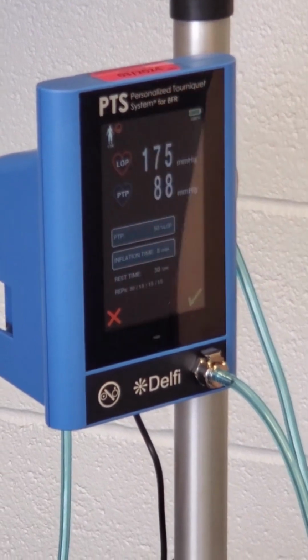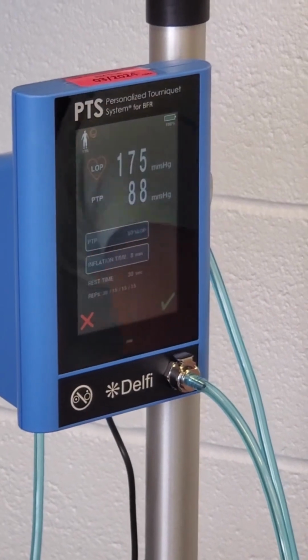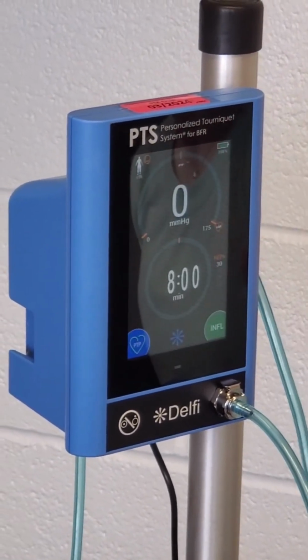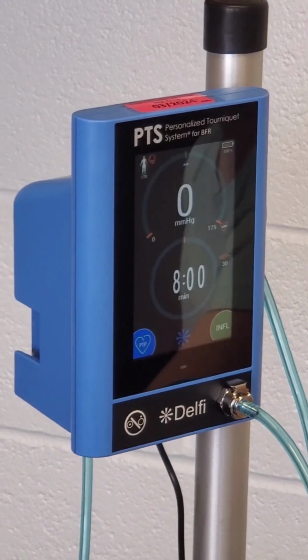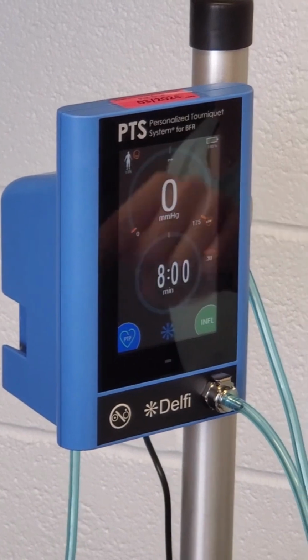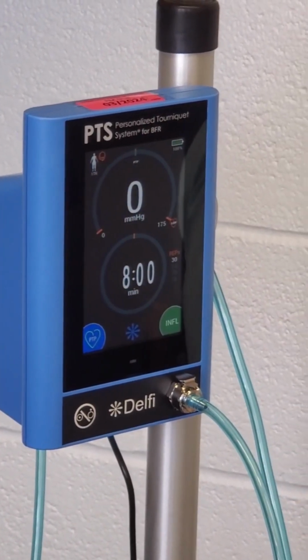It depends. So for lower body, you actually want to be more like 60 to 80%. And actually, that's what I'm going to do. I'm going to hit the check mark. Do you feel any pressure right now? It's off, right? So let's say we were going to do it at 50, but no, for lower, what did I say, 60 to 80% limb occlusion pressure.